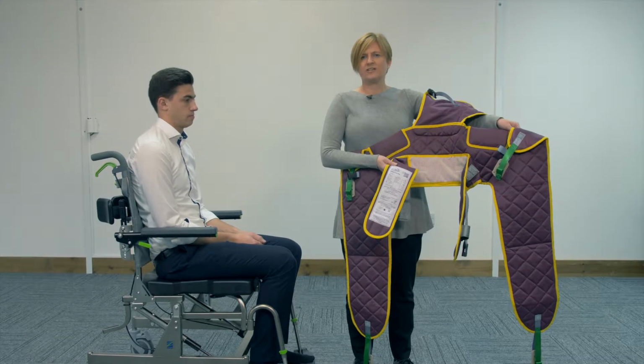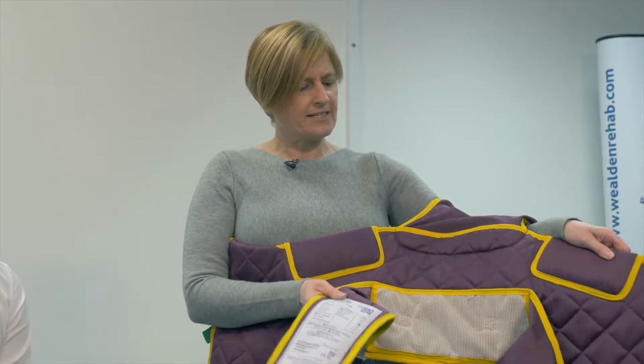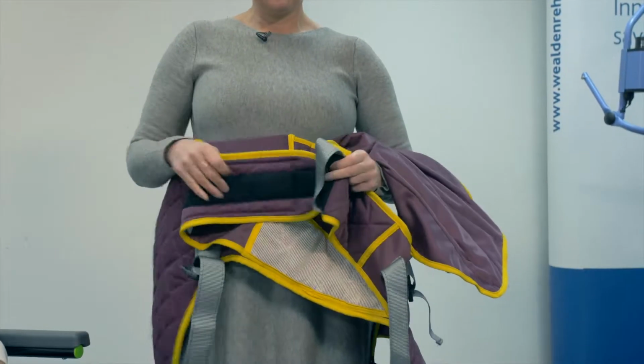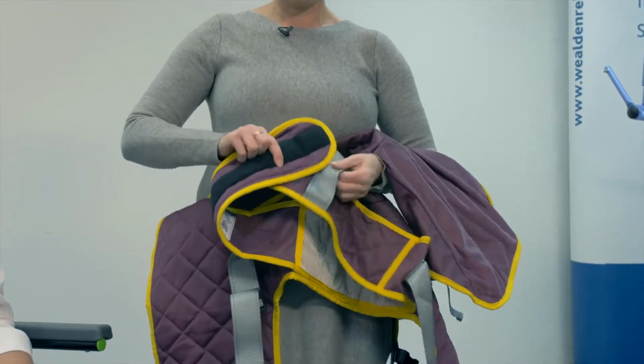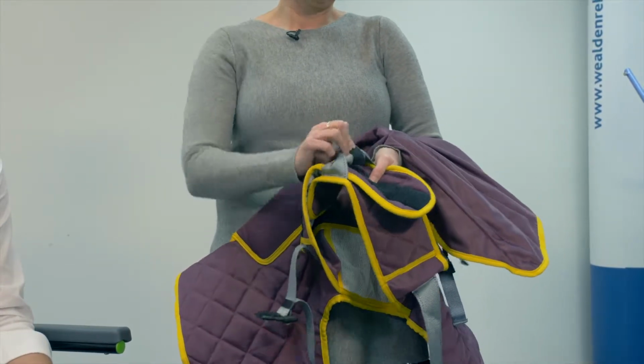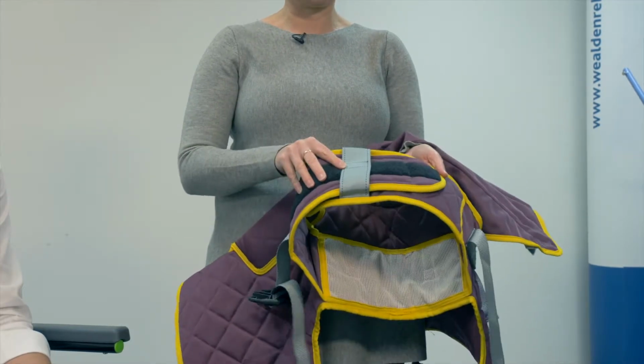This is the Alto Clip-fit Toileting Sling. The sling fits around the trunk with a Velcro belt. You feed the Velcro through this grey strap. On the other side of the grey strap is another section of Velcro that secures that into position.